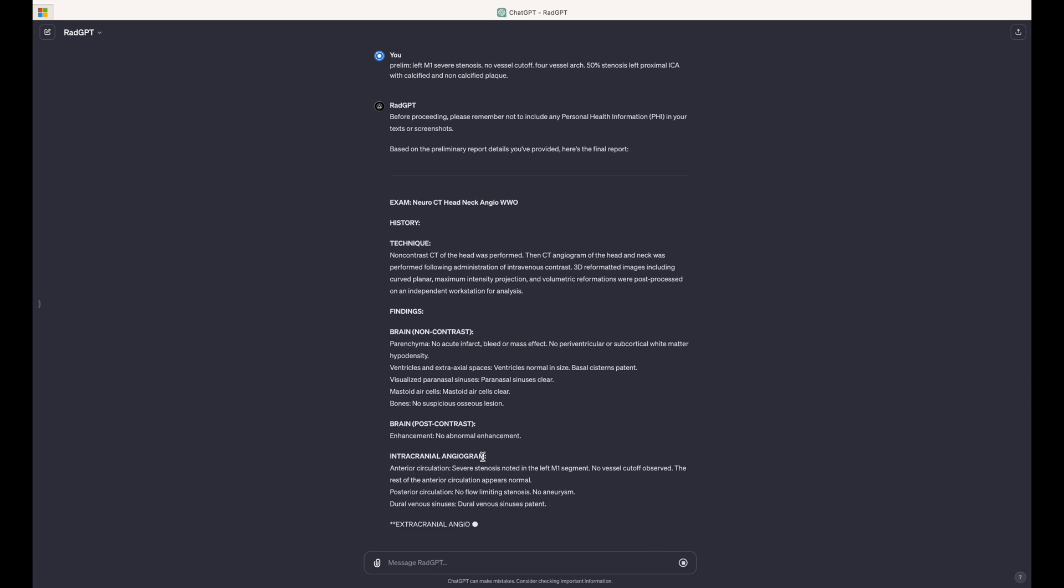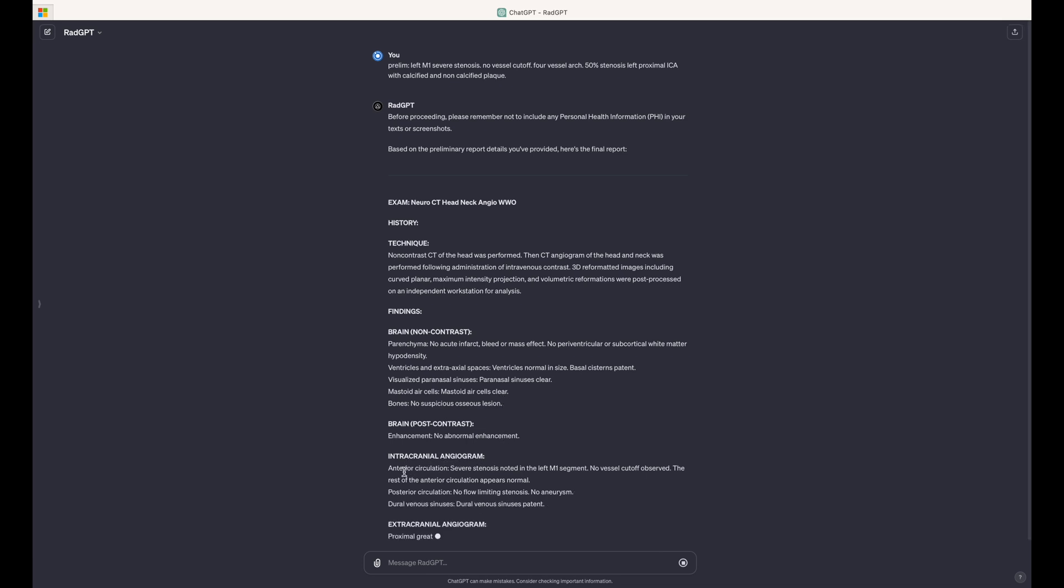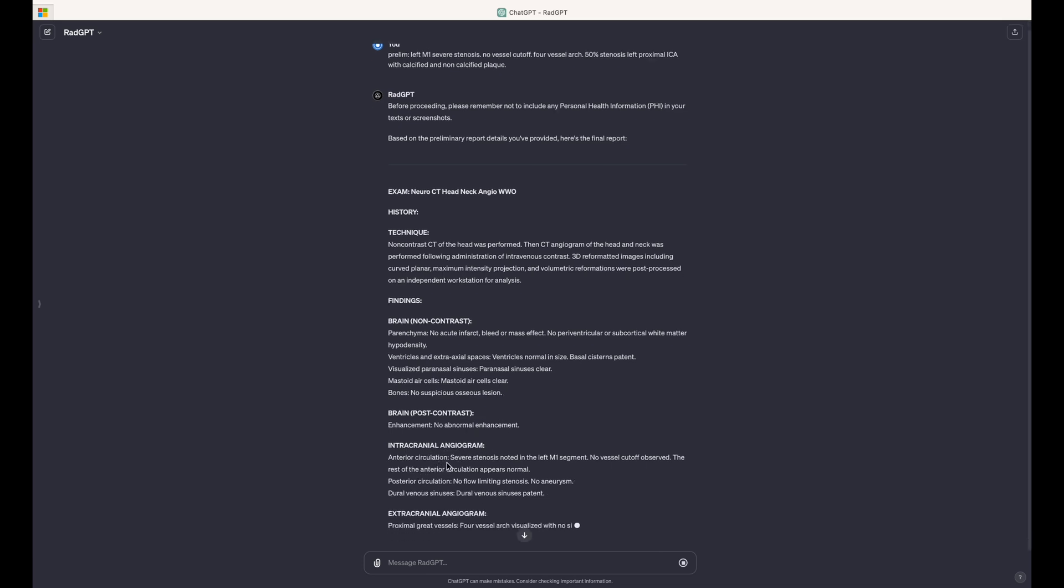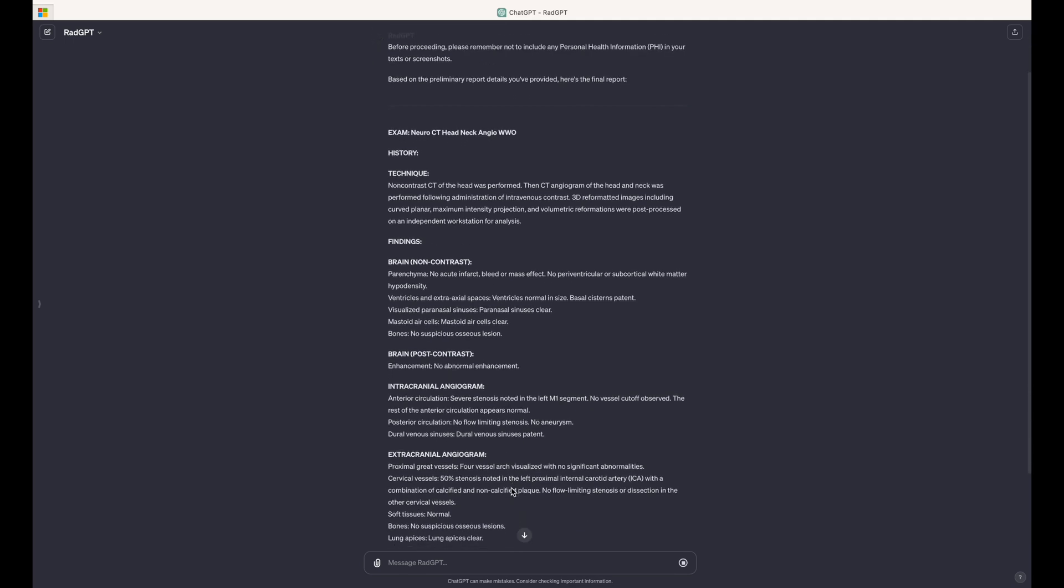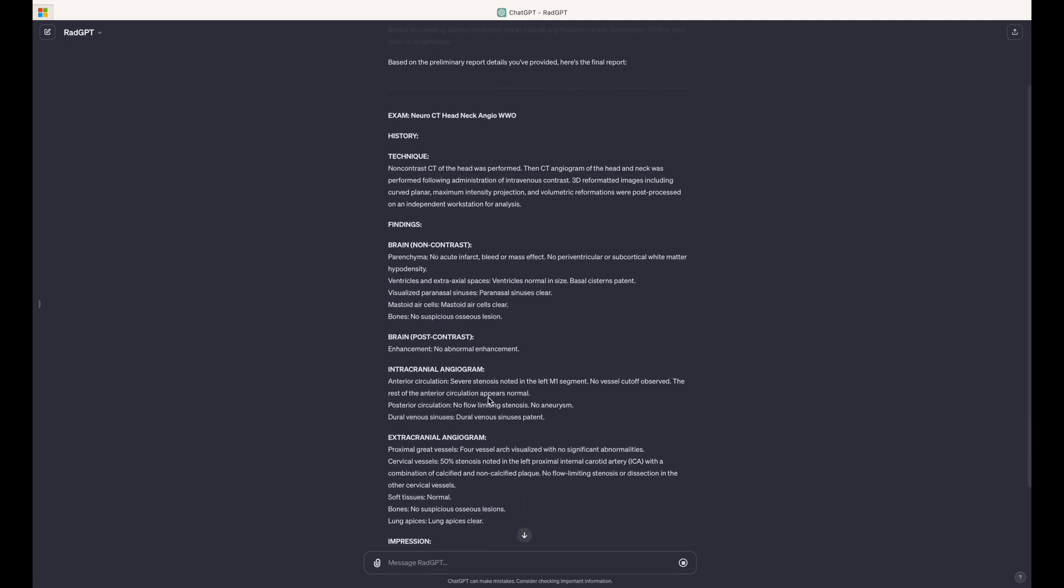So here, intracranial angiogram, it provides in the anterior circulation, the finding of severe stenosis of the left M1. It also provides the pertinent negative that there was no vessel cut off. And then it even modifies the template that previously said the anterior circulation is normal. And instead it says the rest of the anterior circulation is normal, which is phenomenal.